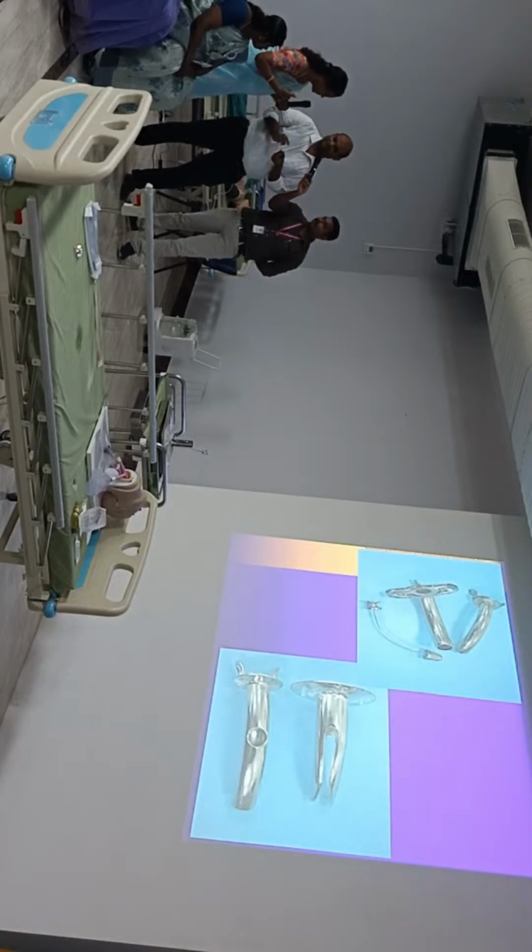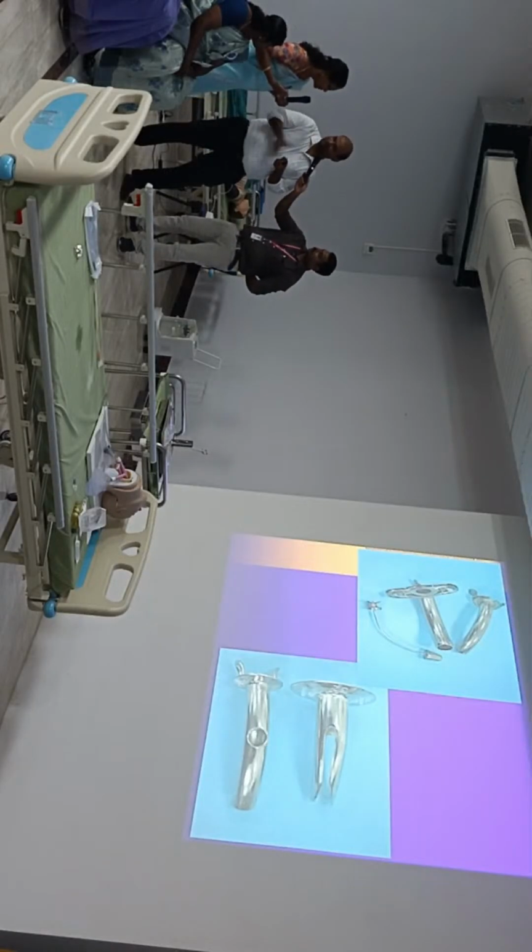In case it gets blocked, both those tubes are at the same level, isn't it? So if the tube gets blocked, the entire tube is blocked. Here, if the tube gets blocked, what will happen? You can remove the inner tube, so the block can be removed and the path will still be patent. This is the same mechanism we are using in the plastic tube.